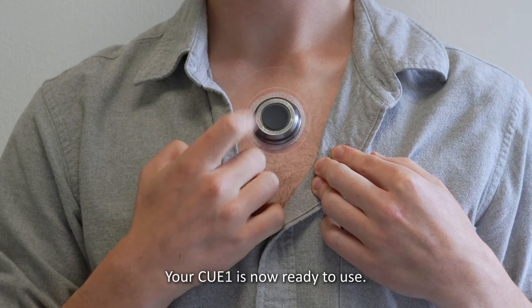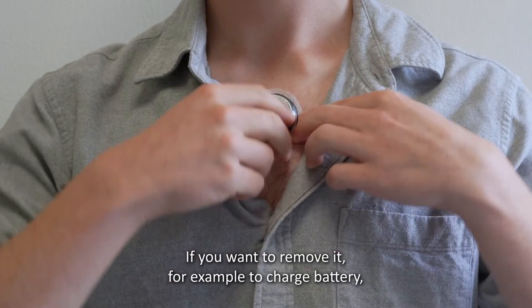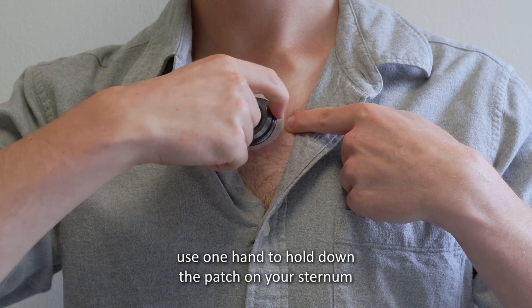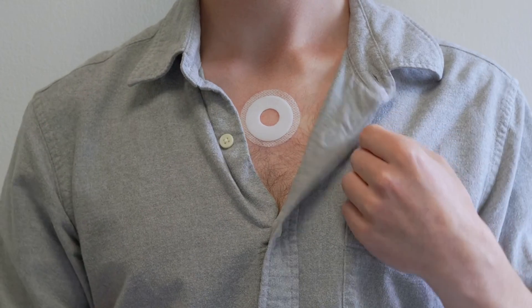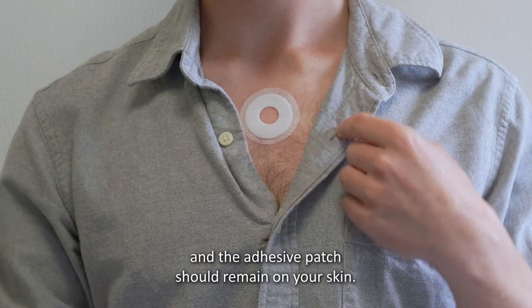Your CUE1 is now ready to use. If you want to remove it, for example to charge the battery, use one hand to hold down the patch on your sternum while using the other to gently pull the CUE1 off. You should hear a click sound and the adhesive patch should remain on your skin.